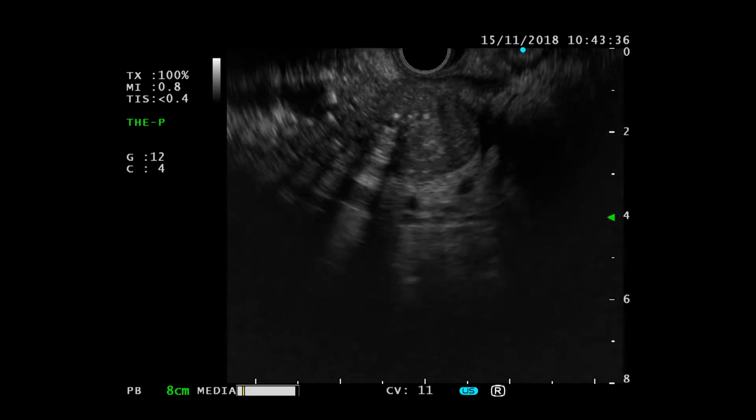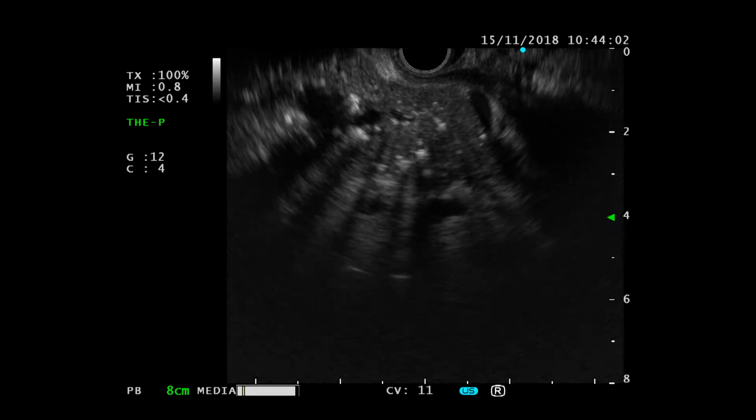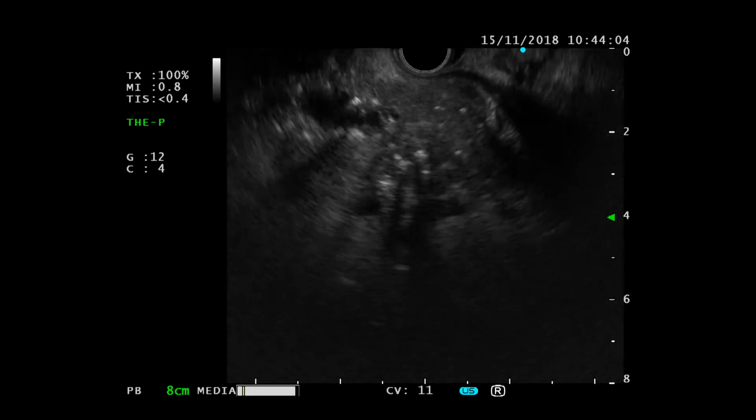Yeah, we totally agree. May I make a provocative question as a non-expert of EUS? I'm concerned that there is a lot of scar tissue in the pancreas. It's probably better to have a very thin FNA needle to get tissue in order to pass more smoothly through the chronic pancreatitis, or do you think that an FNB big needle is good as well as in a normal situation?